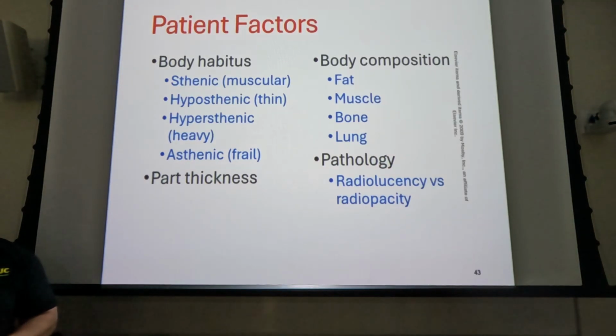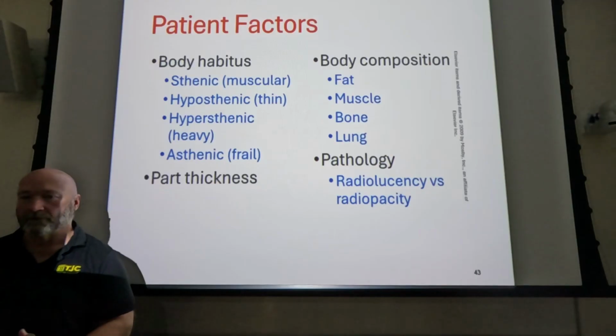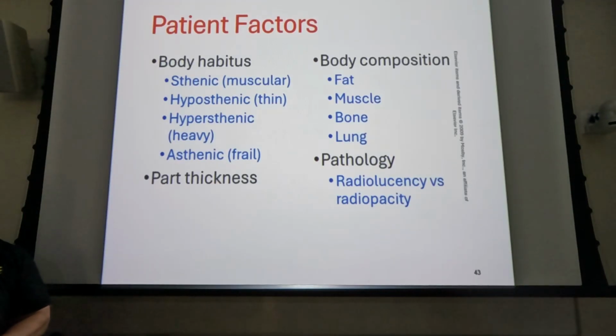All right, so one thing that always trips people up is post-mortem films. Okay, so you're shooting post-mortem images on the patient. Does the patient have the disease?